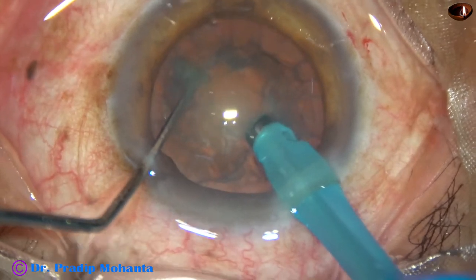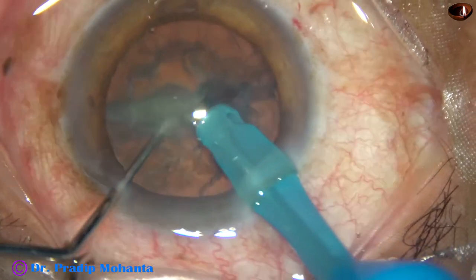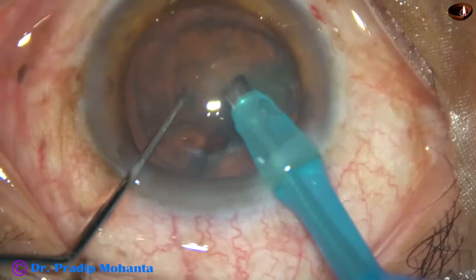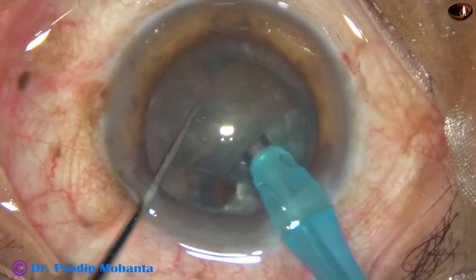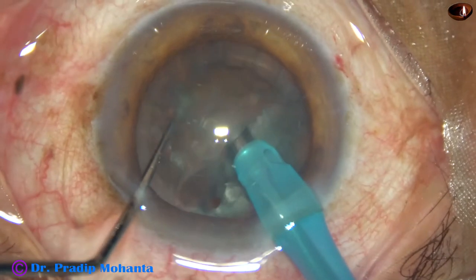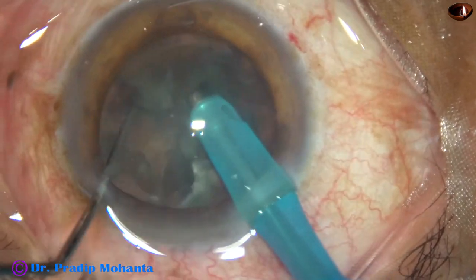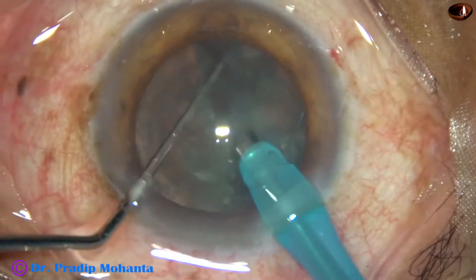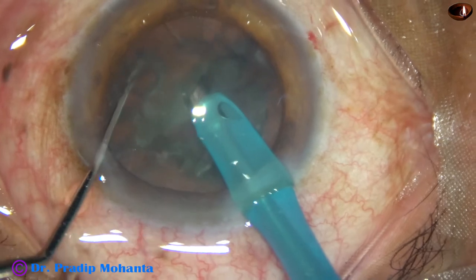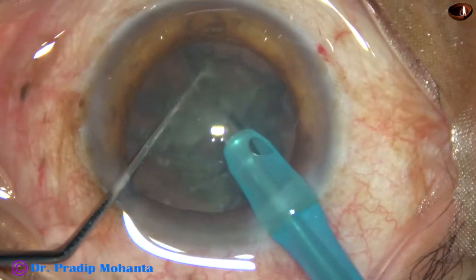Now the phaco needle tip supports the nuclear mass and the chopper is brought from the opposite equator, and the nucleus is chopped. The phaco needle remains in irrigation — no vacuum is used. Similarly, each nuclear half, each heminucleus, is divided in the same way. This is called mechanical chop because no vacuum is used for holding the nucleus.